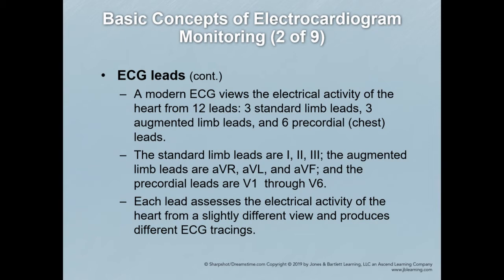Also, please keep in mind that whatever machine you're using uses filters. It decides what it feels like you need to see, what's important. So most of these machines are not in true diagnostic mode because of the artifact that will be associated with that.